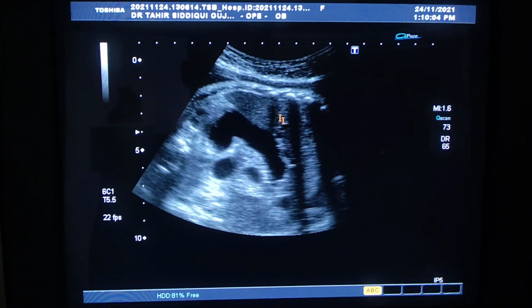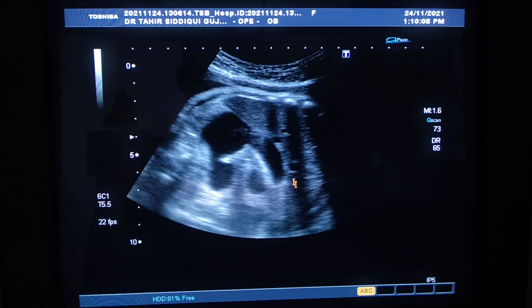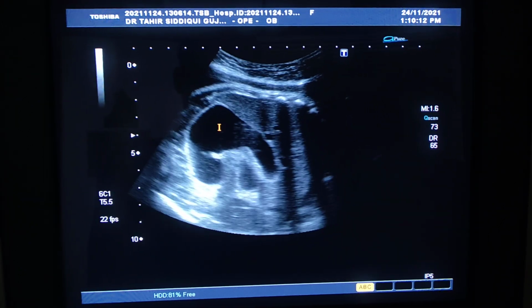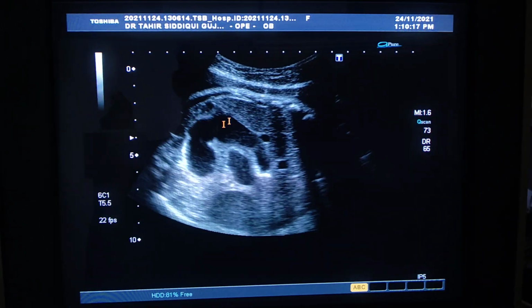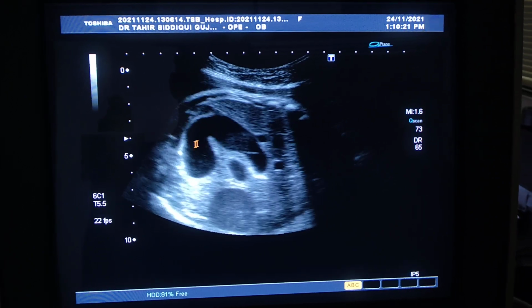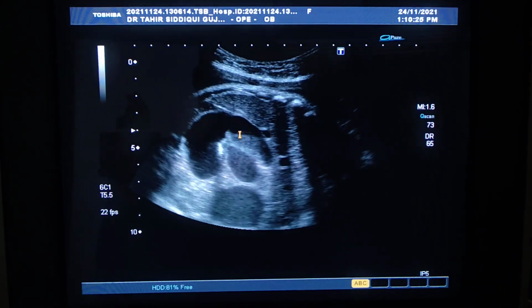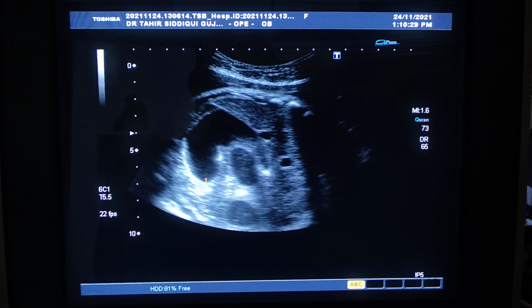That is the liver. This area is the liver, and you remain concentrated on these tubular structures and these cystic areas with the mucosa changing its shape. You see, this is the mucosa, submucosal line.